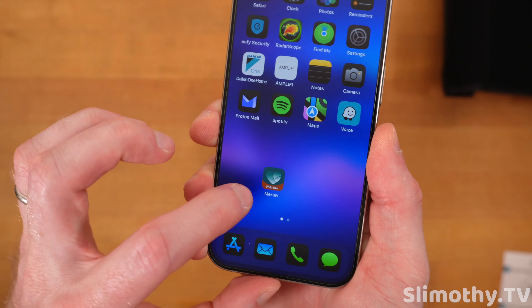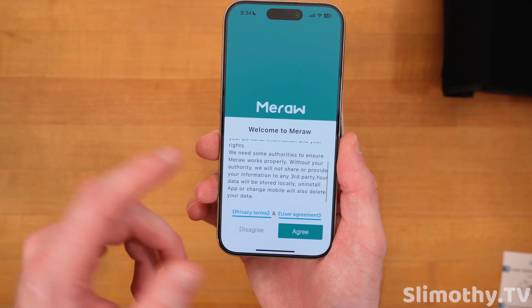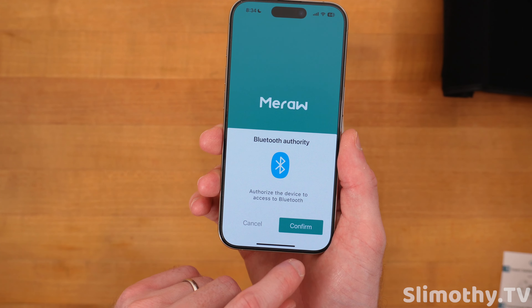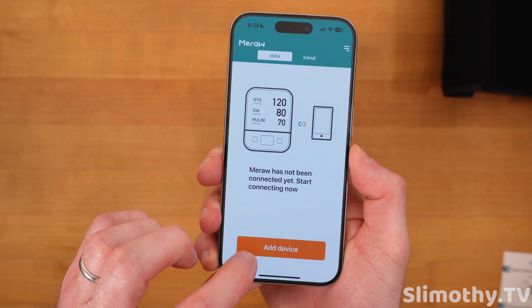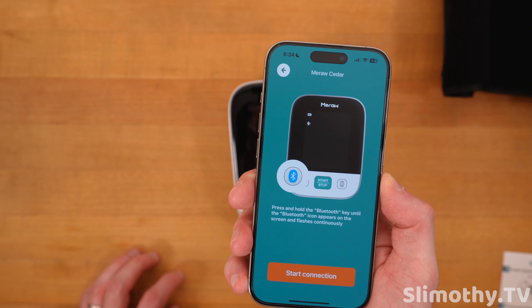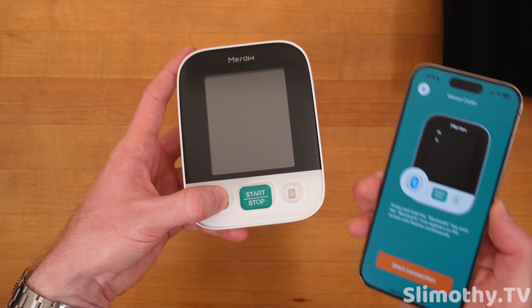I already downloaded the app — it's the Mi-Raw Health app. You have to agree to their terms, and of course we allow. There's a pop-up asking to allow Bluetooth. Let's go ahead and add the device — this is the Cedar series. Press and hold the Bluetooth key until the Bluetooth icon appears and flashes on the screen.